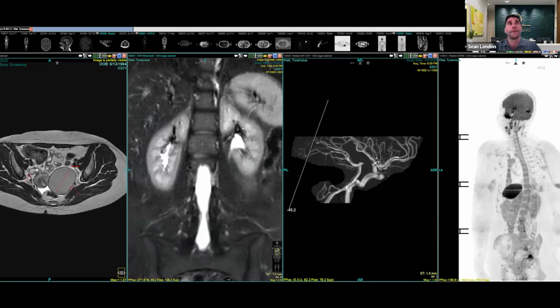And so if I saw that, I would probably suggest that this could be a kidney stone that I can't see and recommend an additional test, CT or ultrasound. Fantastic. Let's see. What other questions do we have here?